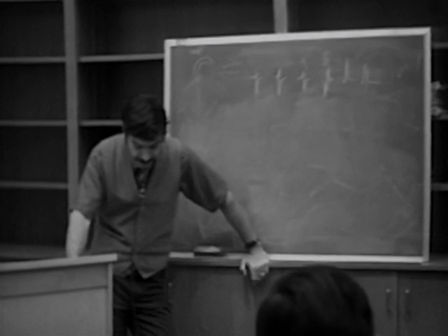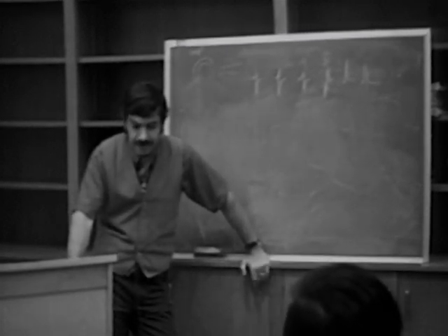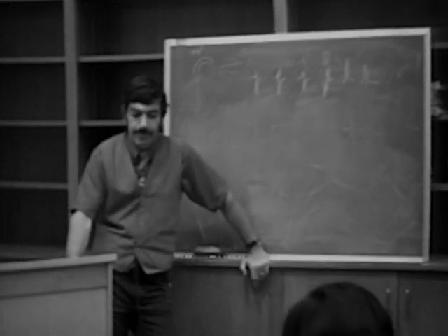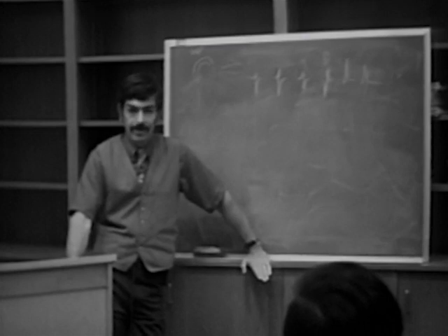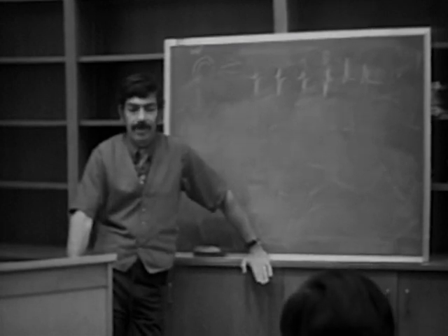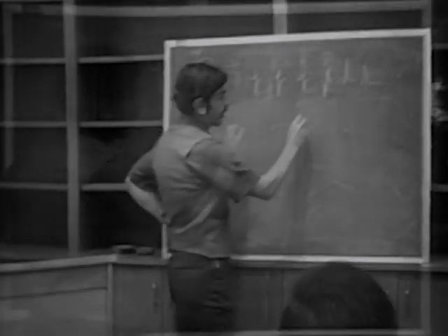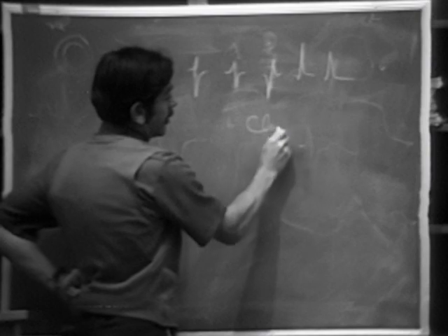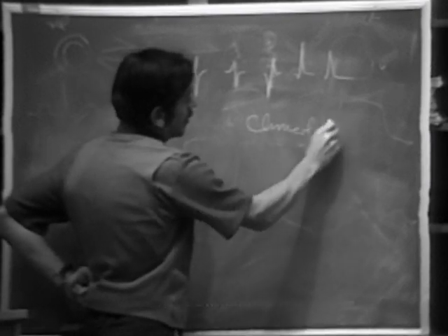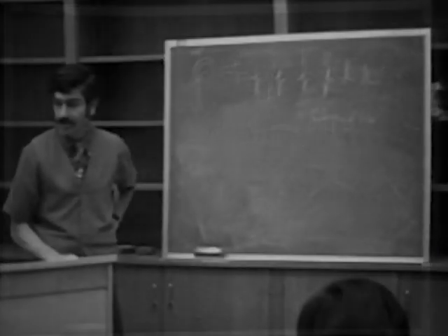Now let me just say that the EKG is certainly a good tool in diagnosing transmural infarctions. It is not anywhere near as satisfactory for diagnosing non-transmural infarctions. The criteria for diagnosis are: one, clinical history, right? The patient's had crushing chest pain, etc., the general story.